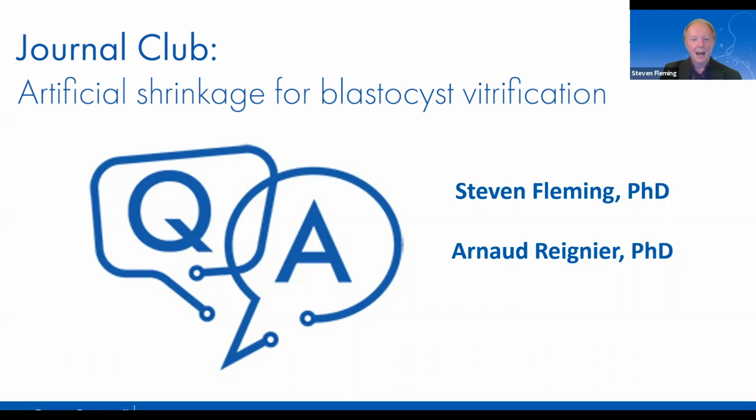Okay. I'm going to throw this one your way, Dave. Nice easy one for you. Should we reduce the equilibrating time when vitrifying collapsed blastocysts? Okay, that's a common question, Steve, as you know. I think the quick answer is yes, you probably should.